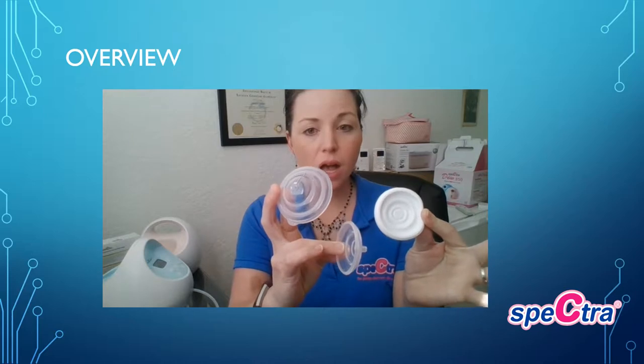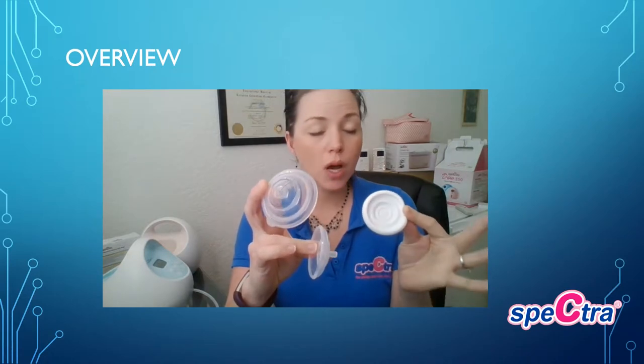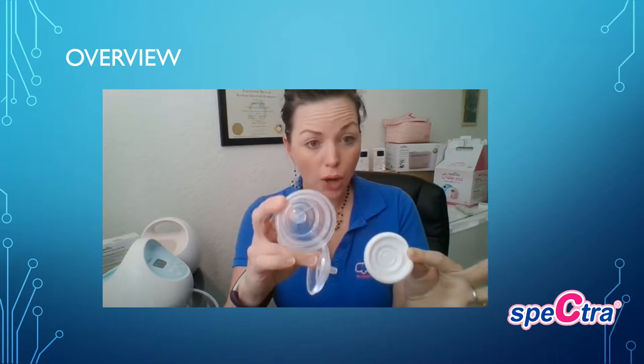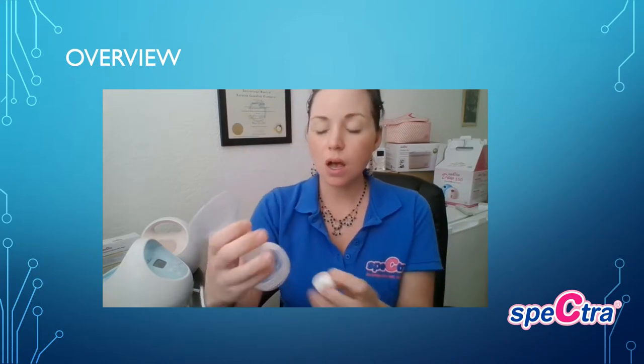I wanted to give a brief overview in reference to the use and cleaning of your S1 or S2 breast pump. When you get your breast pump, you will notice that you have a backflow protector that is three pieces. In the initial instructions it refers to boiling of parts — you do not ever want to use boiling water or a sterilization bag on the actual silicone membrane or the duck bill valve that connects to your flange.